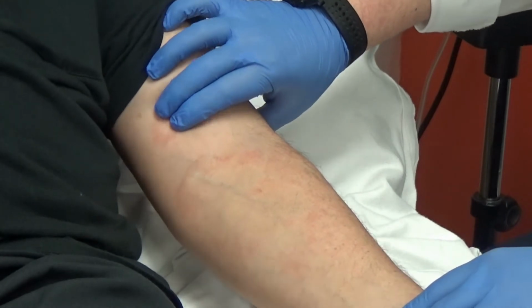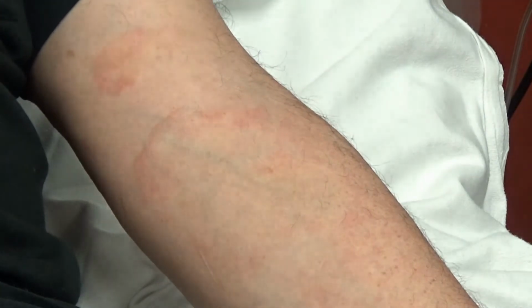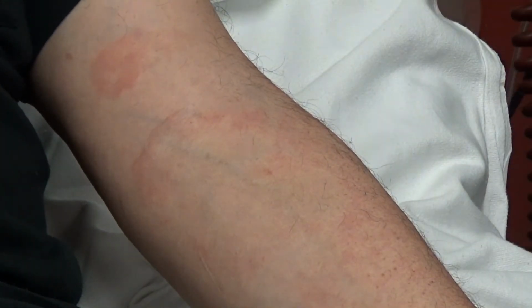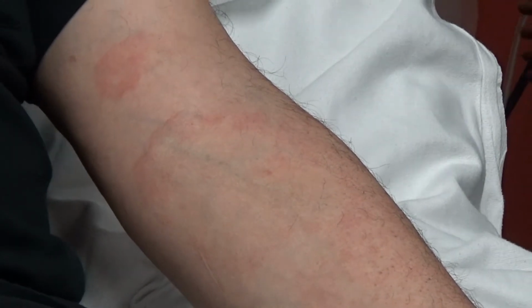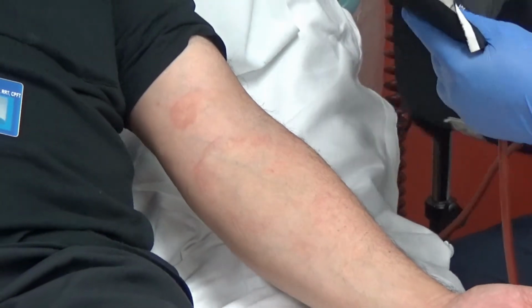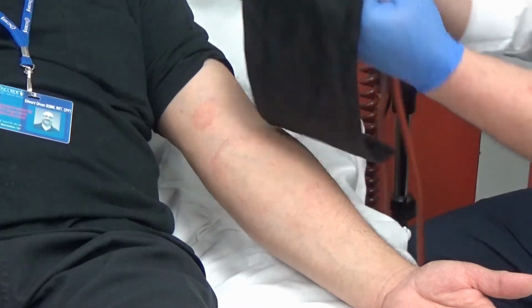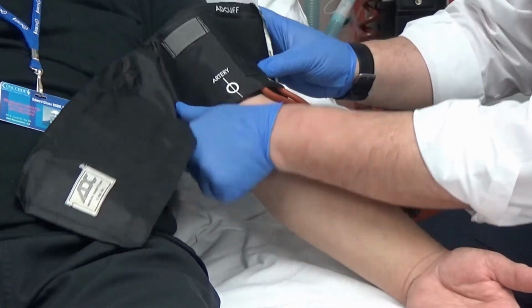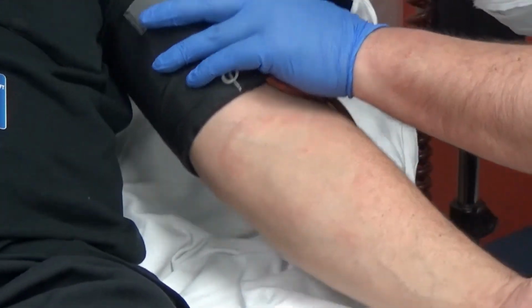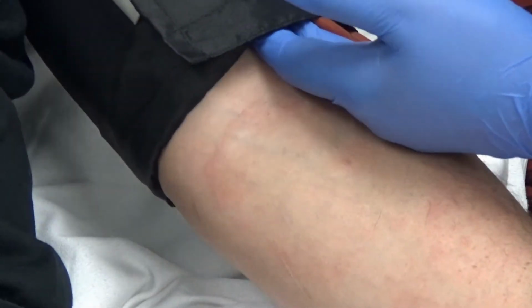And I can feel his brachial pulse is right about in that location right here, okay? Then from there, you'll grab your blood pressure cuff. As you can see here, this is labeled artery, so this would be your brachial artery. I'd place that right there, and wrap this around the arm. You should have about 2 fingers placement in between here.